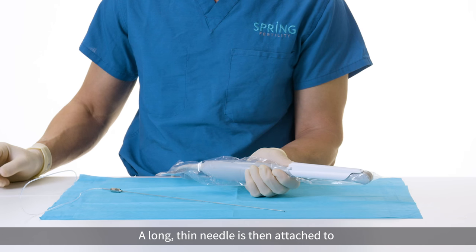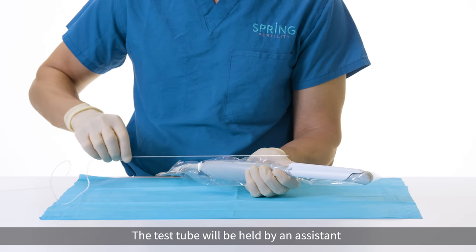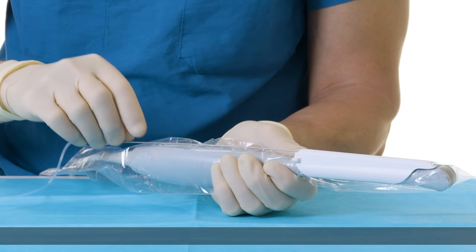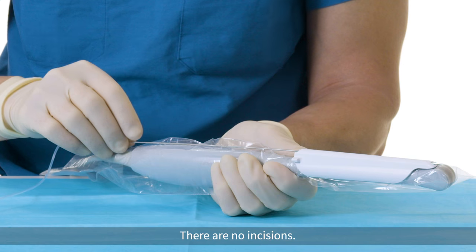A long thin needle is then attached to a warm test tube with buffered media inside. The test tube will be held by an assistant as the needle is inserted into the needle guide. Typically only one puncture is required for each ovary. There are no incisions.